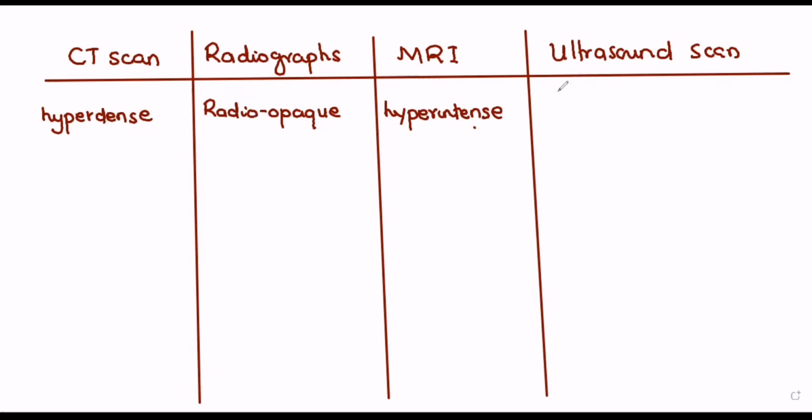How about the ultrasound scan? What term is used? Hyper echoic. The ultrasound uses echo, so hyper echoic. If you are able to reflect a lot, hyper echoic.